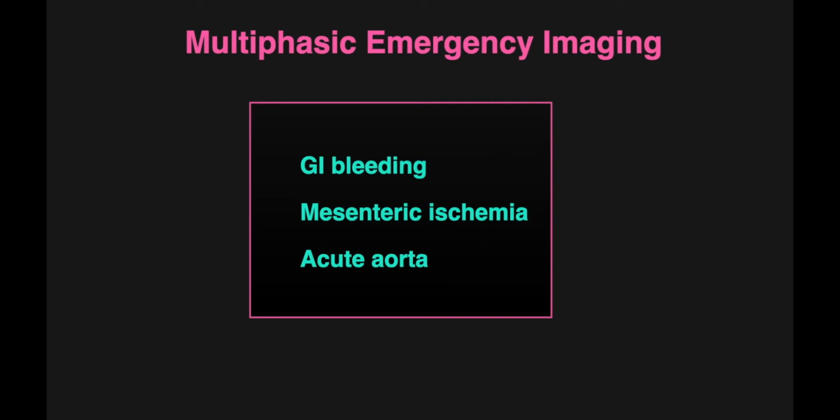So this list covers the major reasons why you'll want to add additional phases in the ER, and as I mentioned, these patients do not need to receive oral contrast.